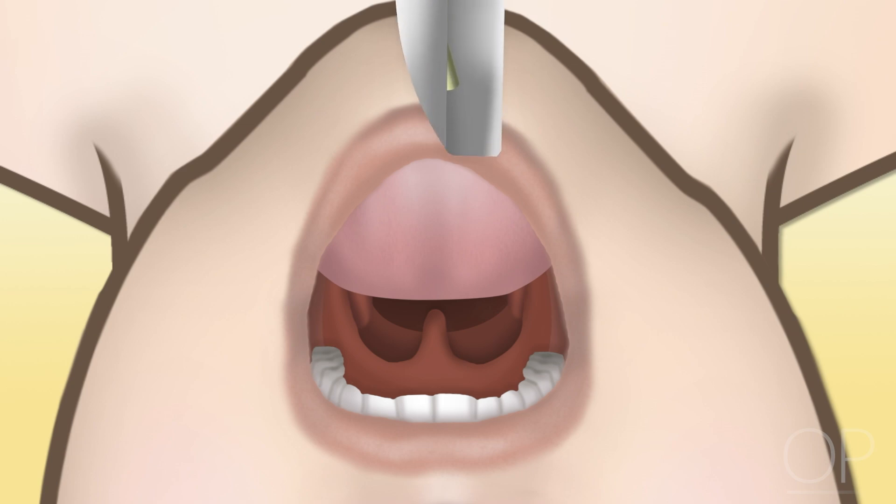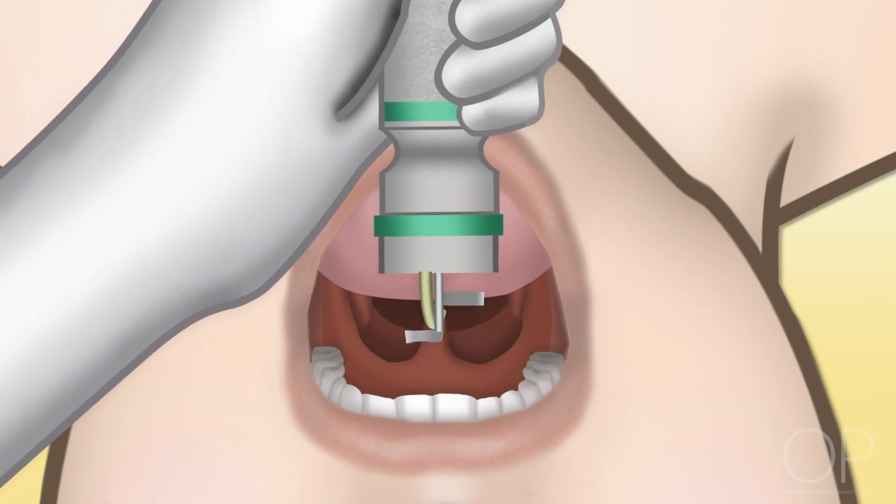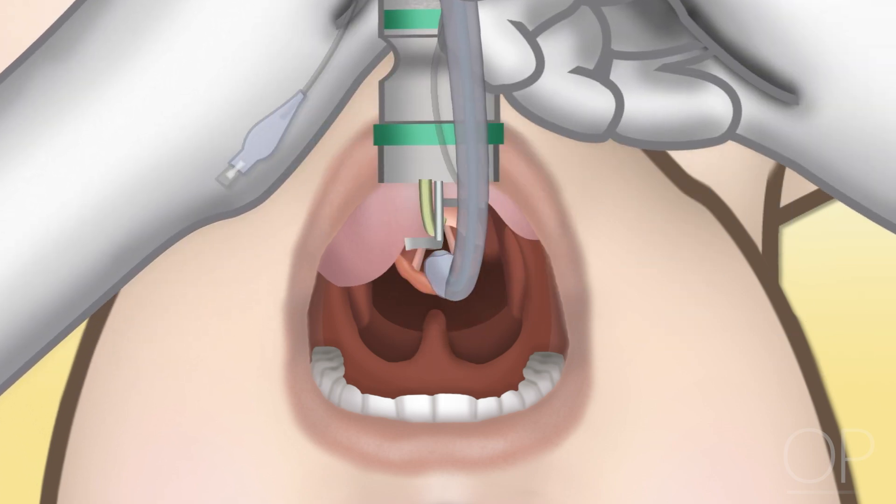An alternative approach of inserting the blade down the midline may also be effective, particularly with intubators with less experience.